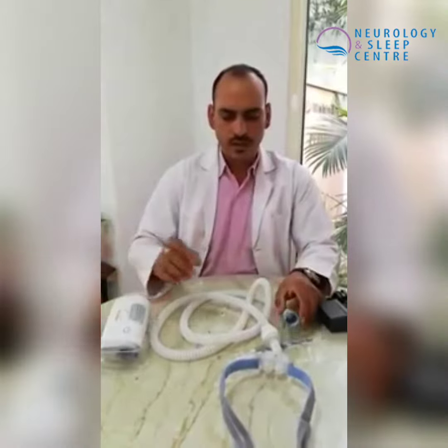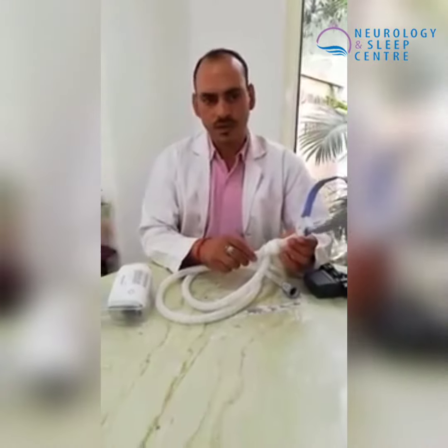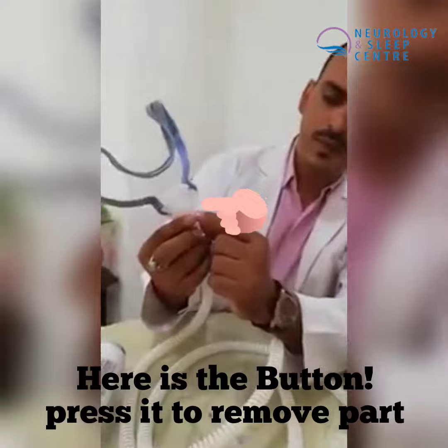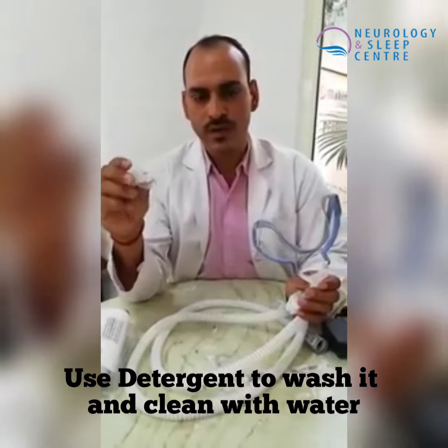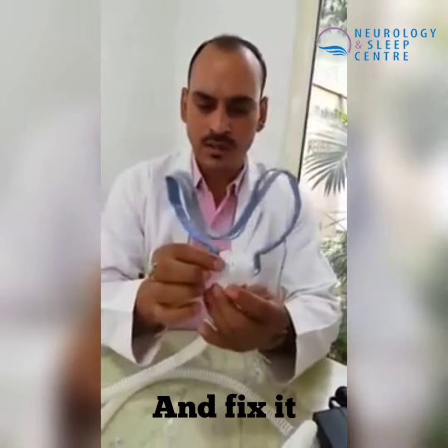There are many patients who use a nasal pillow mask, nasal mask, and full-face mask. Mostly the nasal pillow is what many people want to use. There is a button on the nasal pillow — just click on it and the part is removed. Clean it with liquid detergent. It is good for 3 to 4 times a week. This mask needs to be replaced every month.